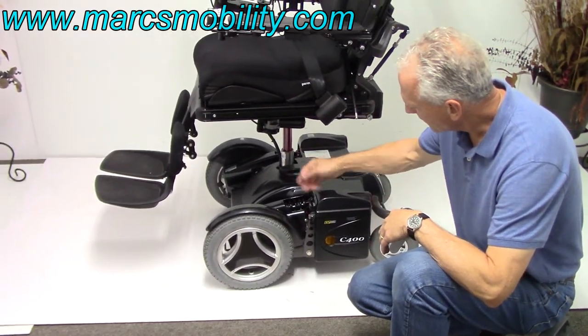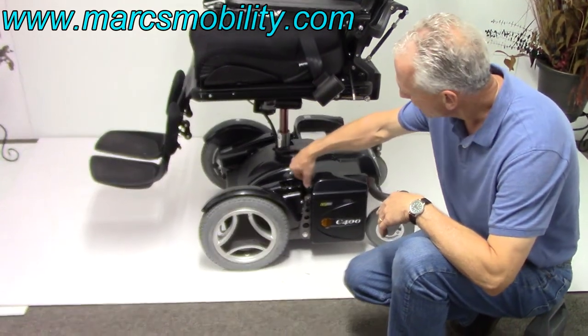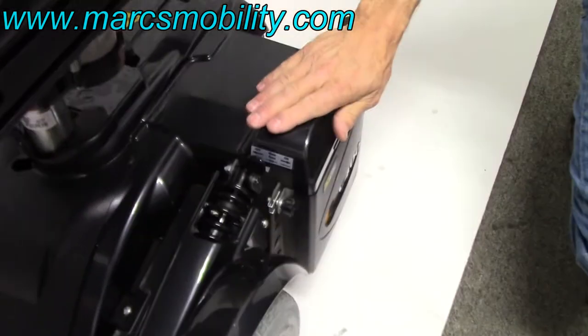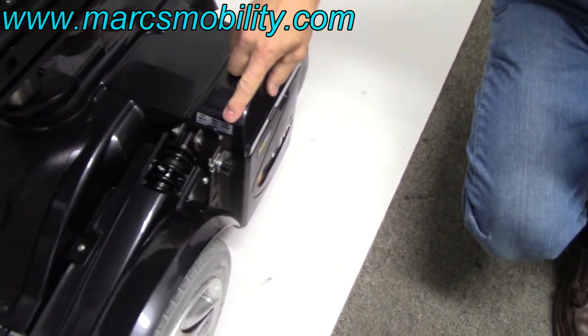You've also got a power button right here. So if you need to turn the power on or off, there's a switch right here — I just turned it off. So when we ship this chair, we'll have this in the off position. If you bring it back, it's back in the on position.